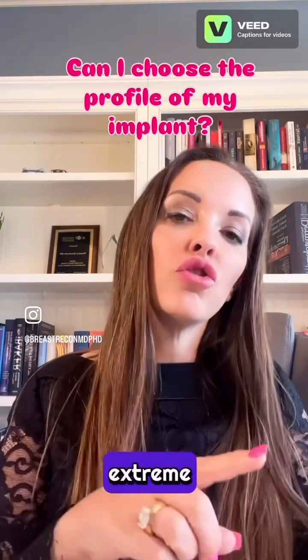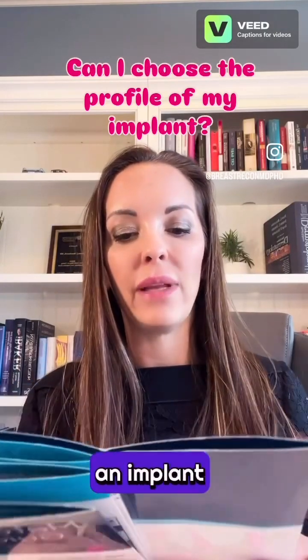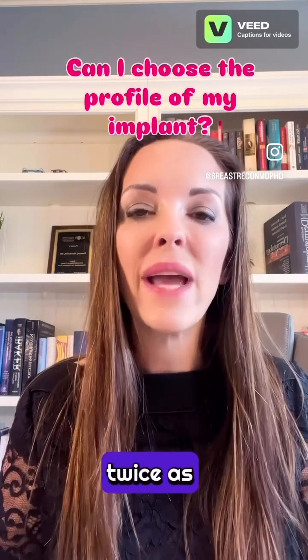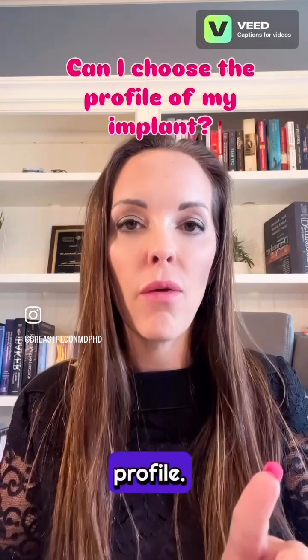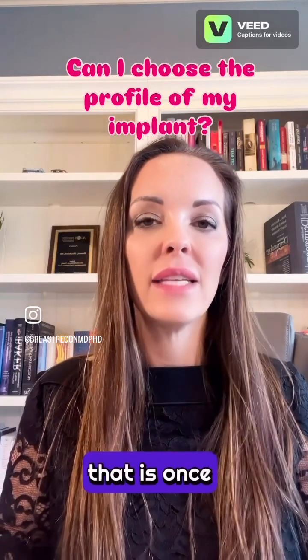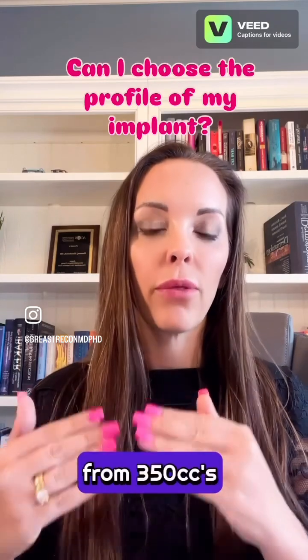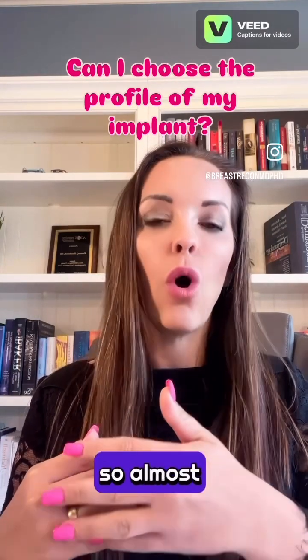Now on the extreme other end, if your base width is 14 and you use an implant that's 650 cc's, so almost twice as large, that's going to be an extra full profile. And the reason for that is, once again, we have the same base width of 14, but we went from 350 cc's to 650 cc's, so almost doubling.